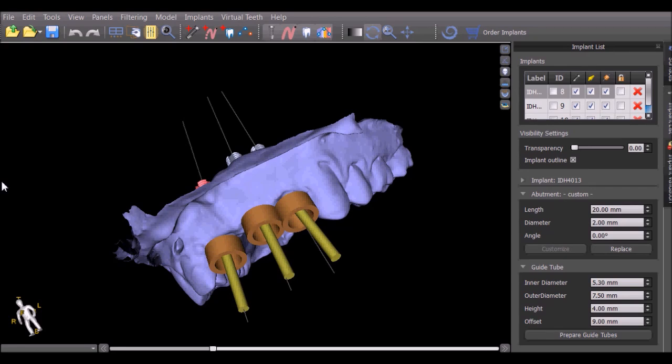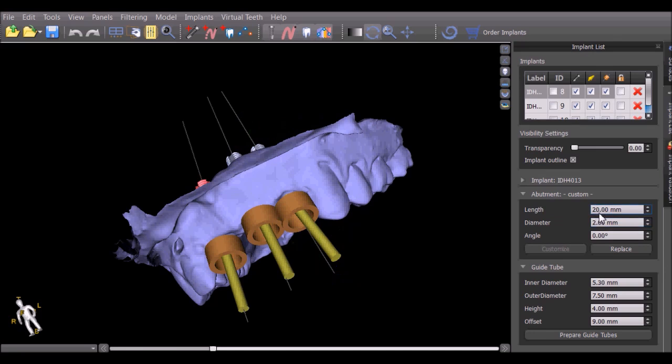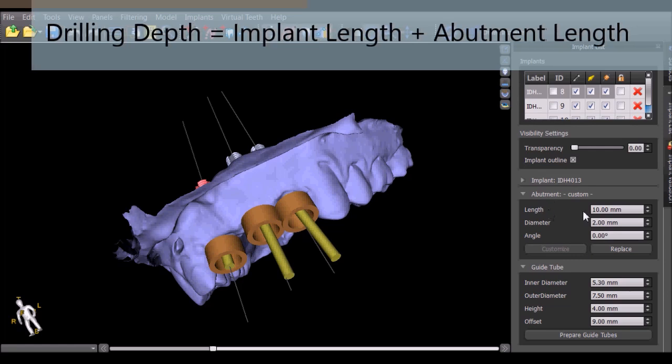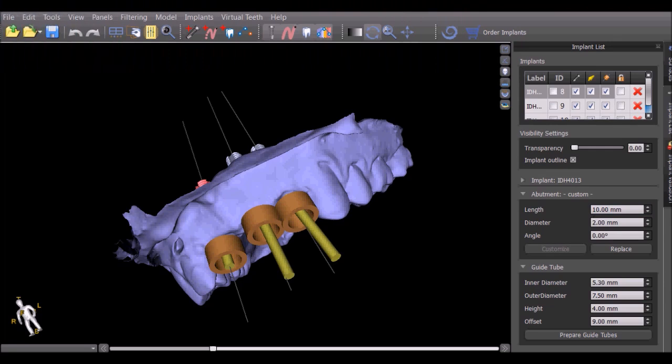The first thing we want to do is to change the settings of the abutments so that the metal cylinder that will be in the surgical guide can properly fit over them. The length of the custom abutment should be changed to 10 millimeters. The top of the metal cylinder will be flush with the top of the custom abutment. The drilling depth is the length of the implant plus the length of the custom abutment as we're defining it here. The length can be changed to accommodate a particular drill stop as necessary.